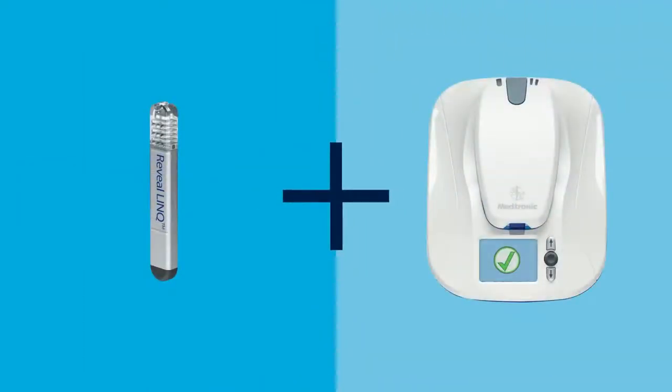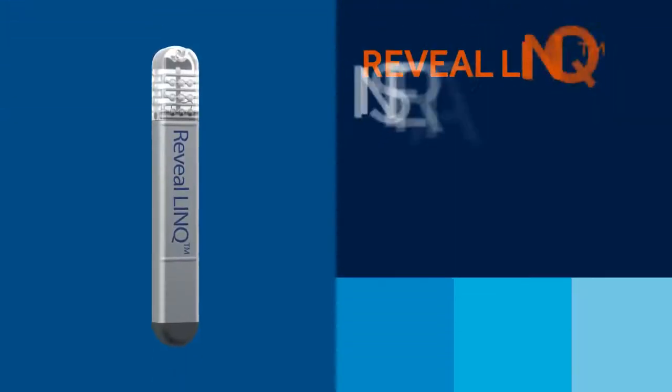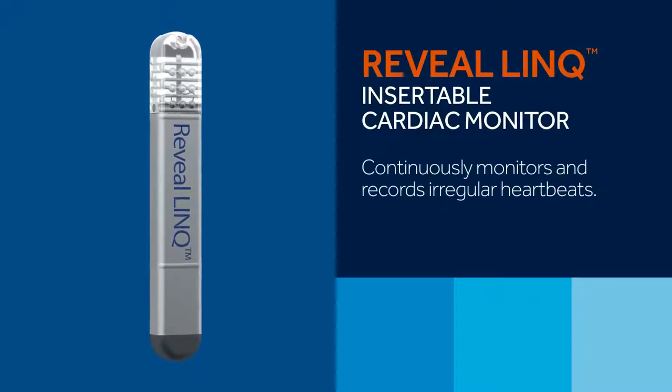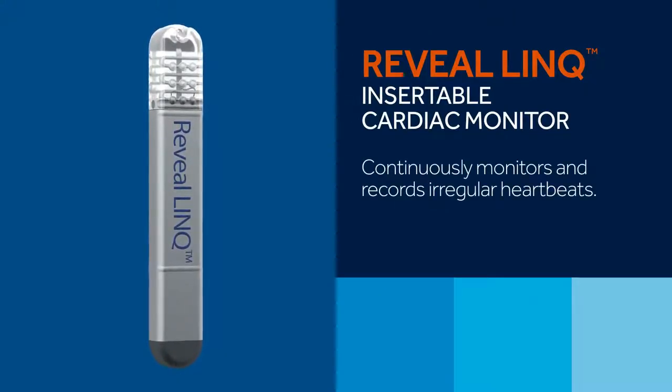Now, let's review the components of the system and how they work together. The system has two primary components needed to capture heart information and send it to your doctor. The Reveal LINQ Insertable Cardiac Monitor, or ICM, continuously monitors and records irregular heartbeats.